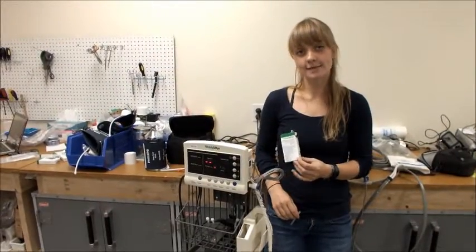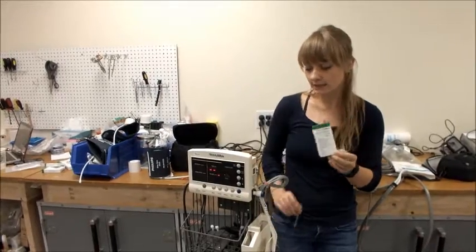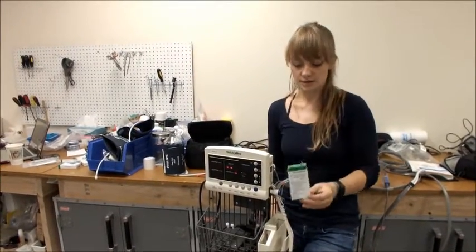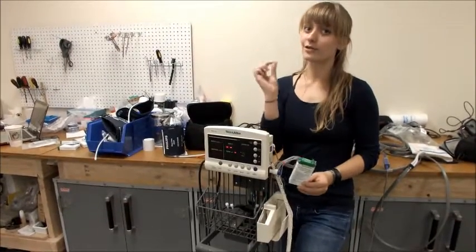When you have a working temperature probe, you're going to need to leave the device with about five to ten boxes of the disposable thermometer probes, and you can throw your old one away.